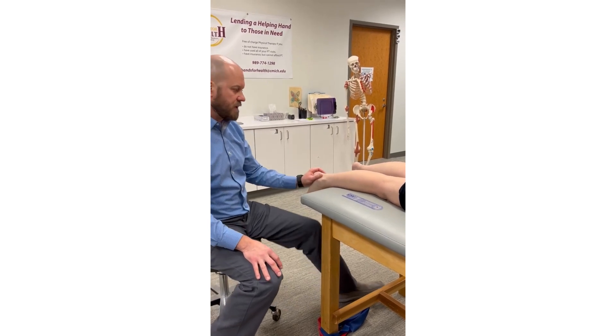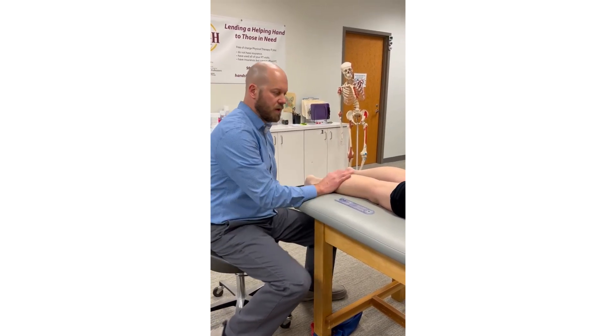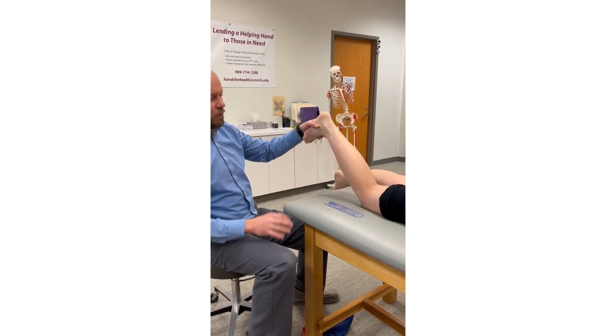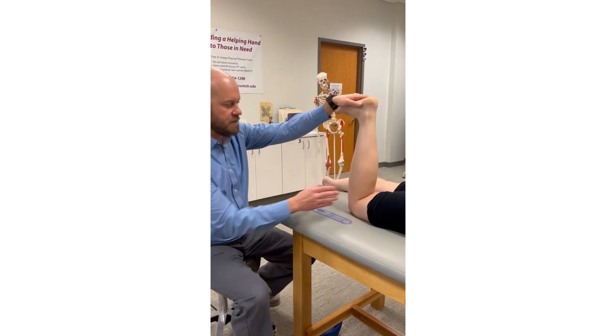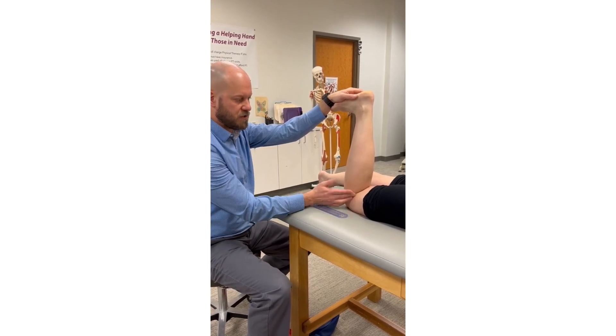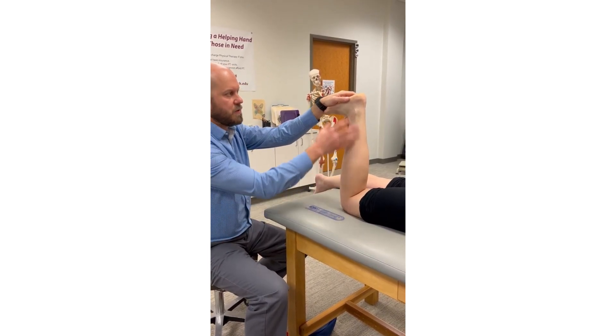Let's measure ankle dorsiflexion range of motion, or talocrural joint dorsiflexion. This is in a non-weight bearing position. We're going to flex the knee to make sure that the multi-joint muscle, the gastrocnemius, is in a shortened position at the knee so it's not limiting ankle dorsiflexion.